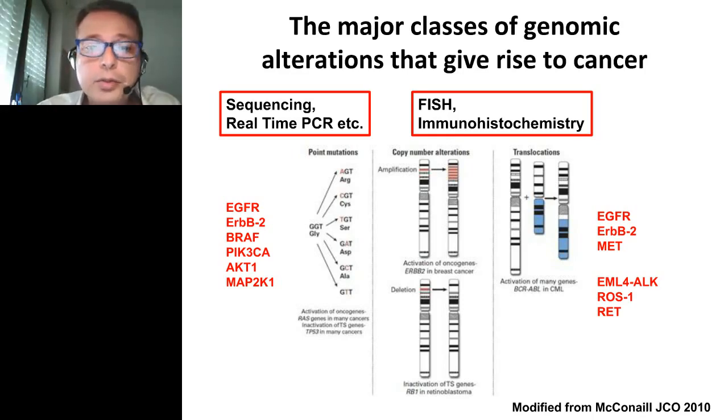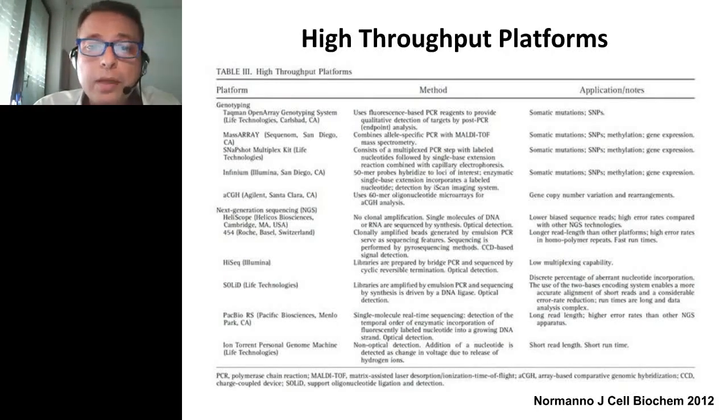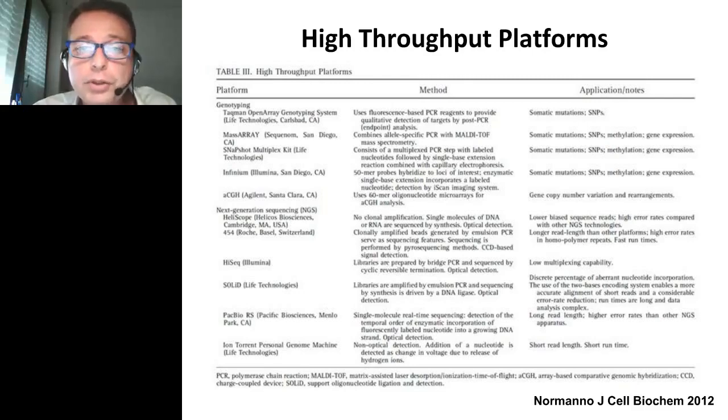Of course, next-generation sequencing can be also used for whole exome or whole genome sequencing, or can be used only for targeted sequencing. What I believe is that now, and for a long time, the most used application of next-generation sequencing will be targeted sequencing, that will allow multiplex hotspot mutation testing to assess at least the most common mutations, and more comprehensive molecular characterizations like whole exome or genome will be limited to those cases that are negative to the first level of screening, or unusual response, so to a limited number of samples.